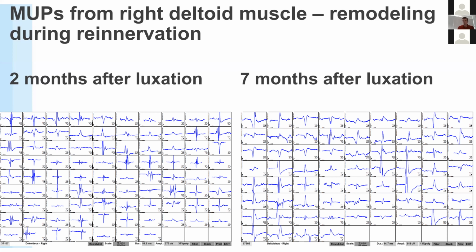So during all these qualitative evaluations, the neurophysiologist has to be very patient and filter single motor units, which is not easy because we have to ask the patient just to contract a very small contraction of one muscle, which is very difficult.